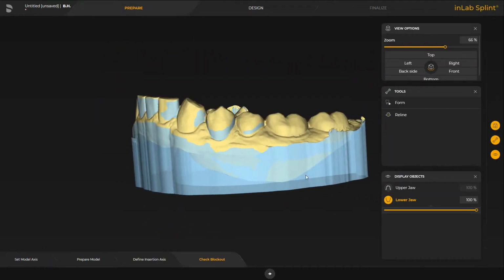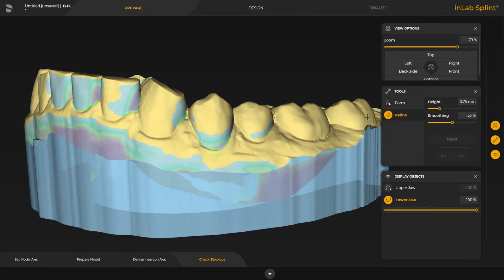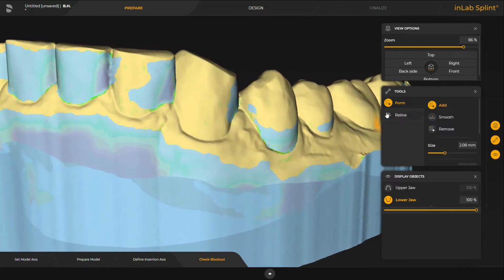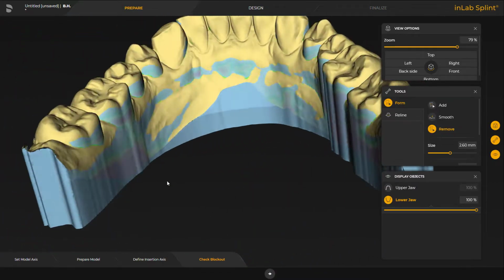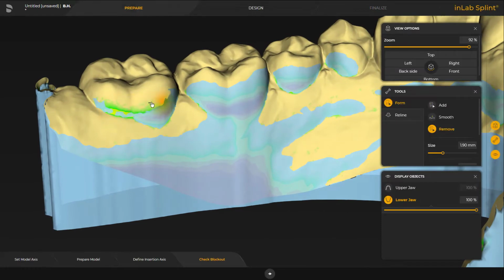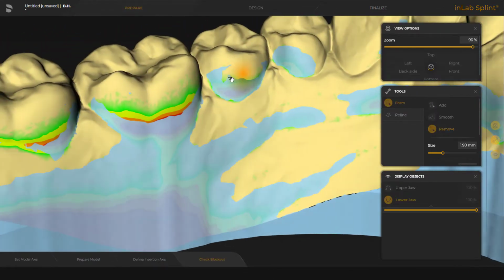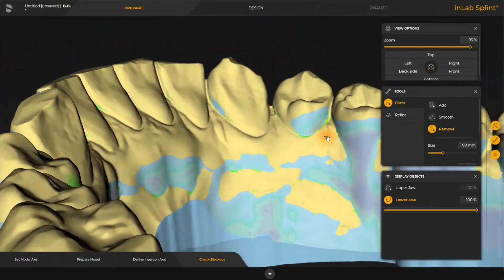And we deactivate the upper jaw. And to visualize the undercuts, we click on Reline, and now you see the undercuts here. To change my blocked out area, we use the form tool here with adding, smooth, or remove. And now I'm taking away the buccal part, and on the lingual part, I will remove until the orange area to get an active fit. So it will snap on when the patient puts it in the mouth.